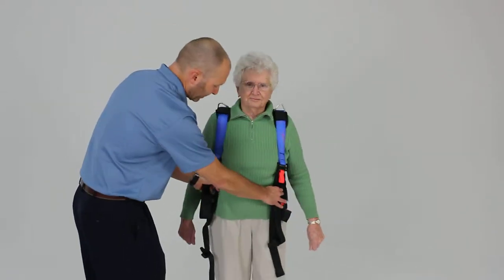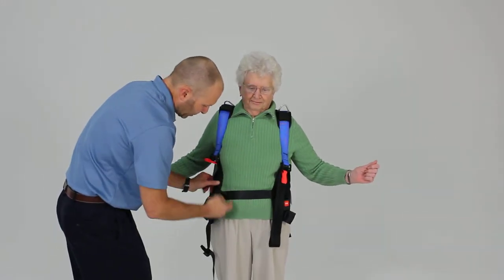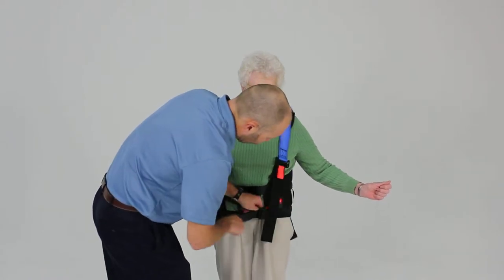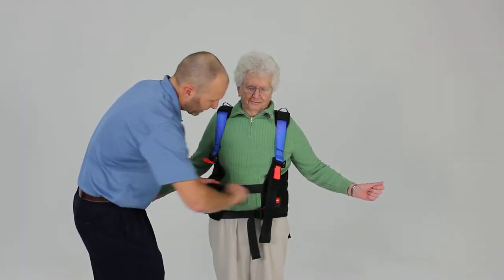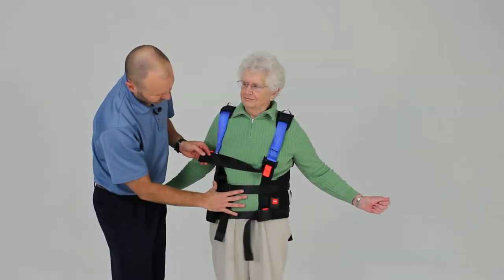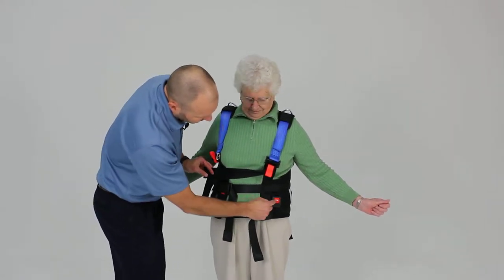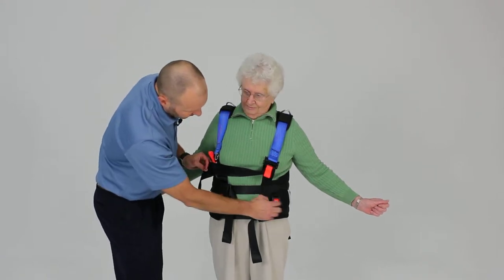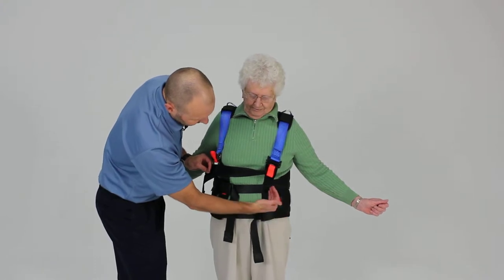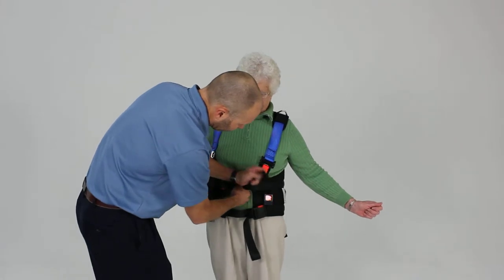We're going to go ahead and snap our front belt in, which has got two clips. One of the key features of this particular harness is you want to tighten the front up so that these two front buckles — with the red press on the buckles — are in front of or just at the ASIS. You want those a little bit in front of the patient, just like we see here. This is a good position.